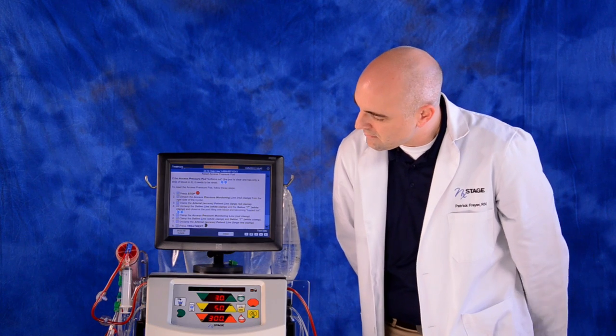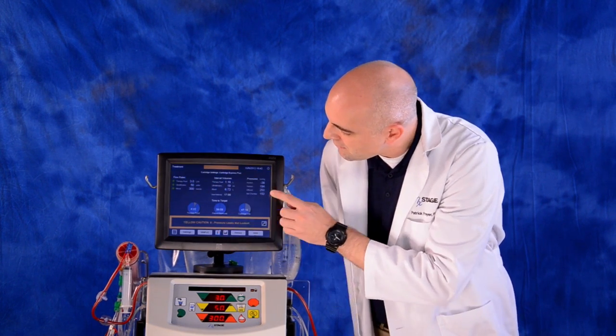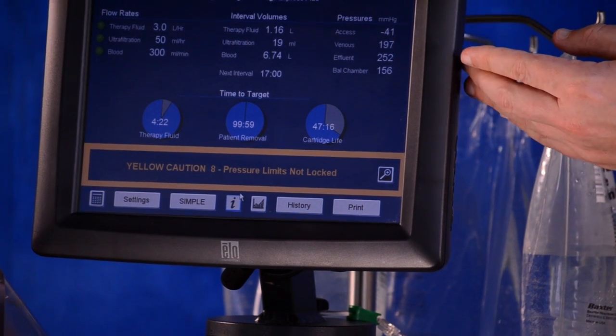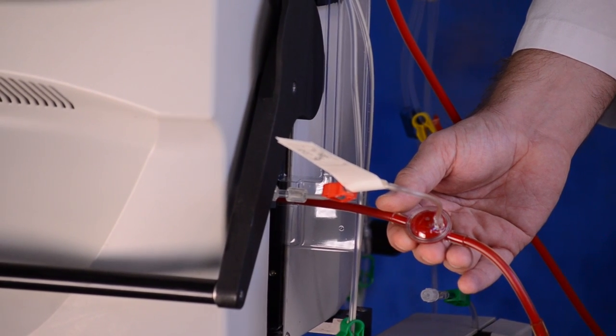Verify the access pressure on the one view is within normal range. Also verify the pod is full of blood and fluctuating with an indentation no bigger than a dime.